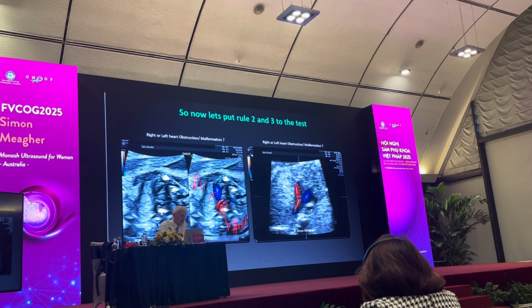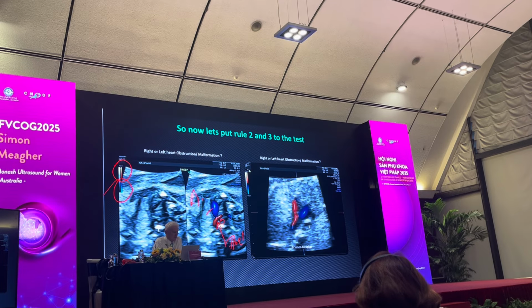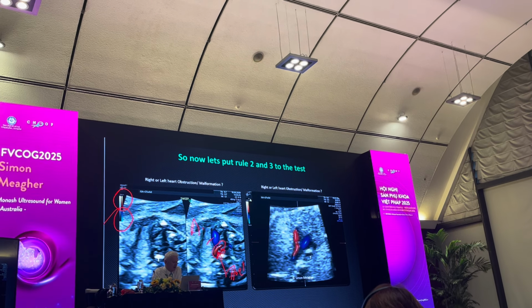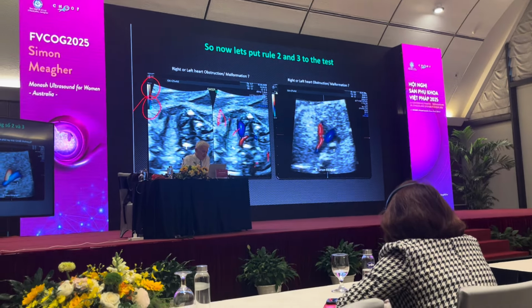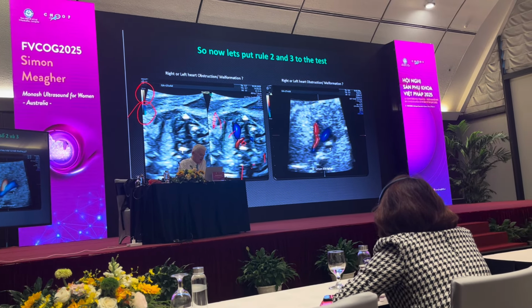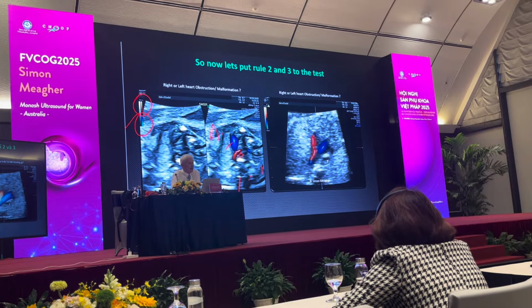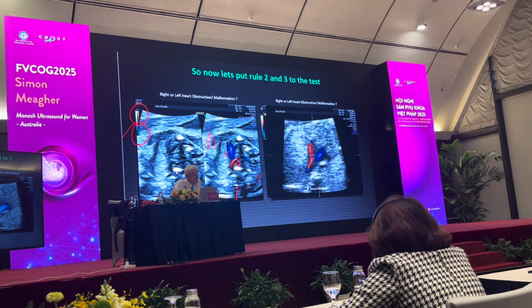And I told you that red is always inflow and outflow is always blue. And the flow in the transverse aortic arch is red. So there is reversal of flow in the vessel closest to the trachea, which tells me that this is a left heart lesion. That this baby is going to require prostaglandins after birth, by that single image.